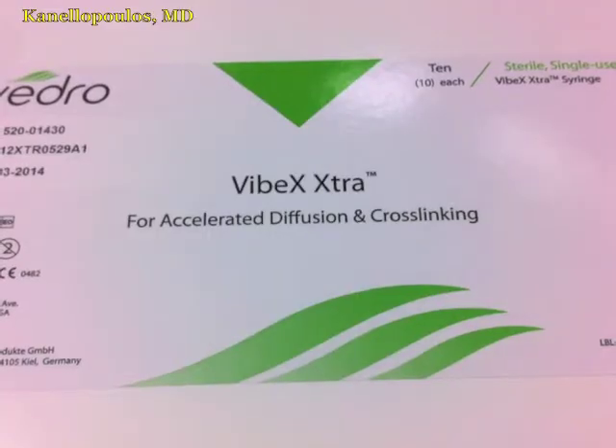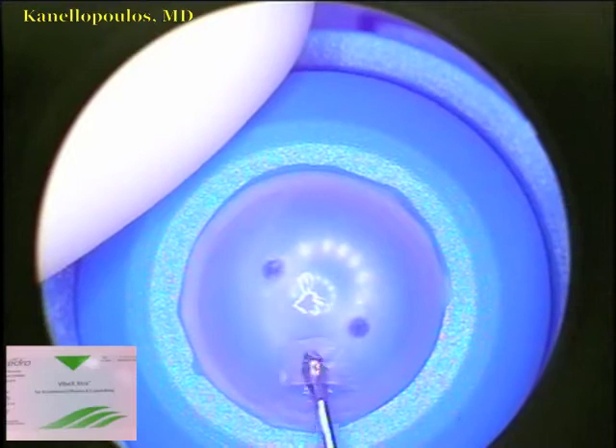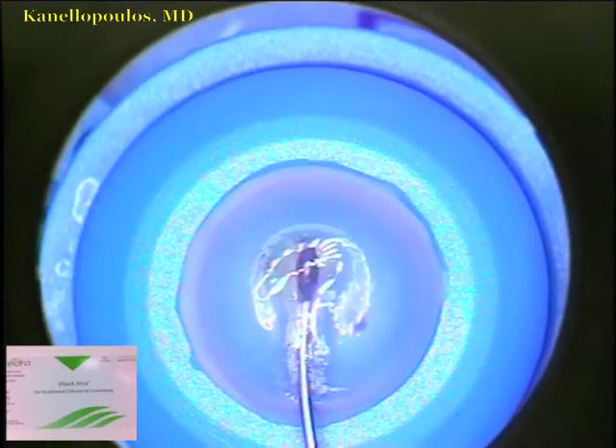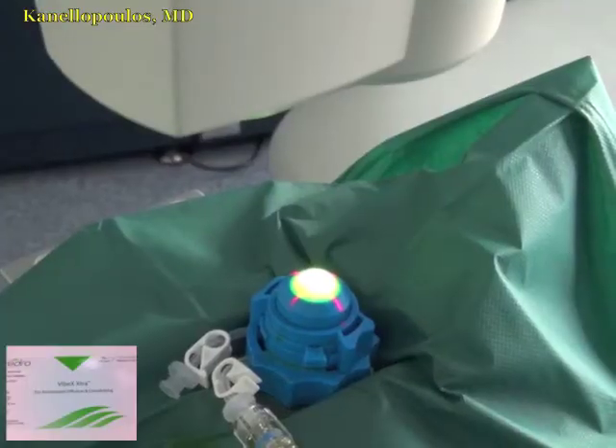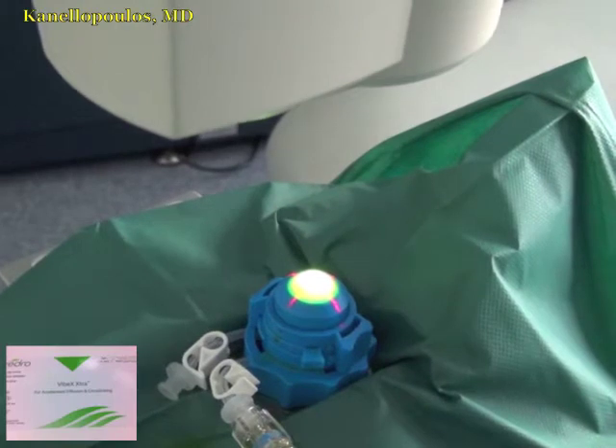It's very good — it's patent. We'll use Vibex Extra, 0.25% riboflavin, seen here with an olive tip cannula instilled within the pocket and not on the surface of the cornea. I want to underline that. Then very high-fluence cross-linking: 7.2 joules.